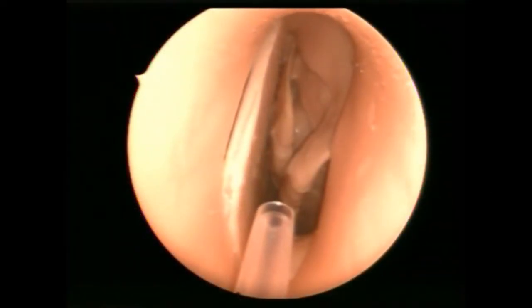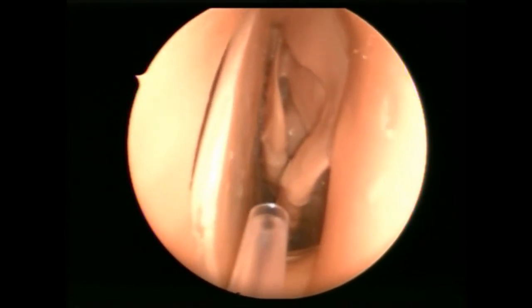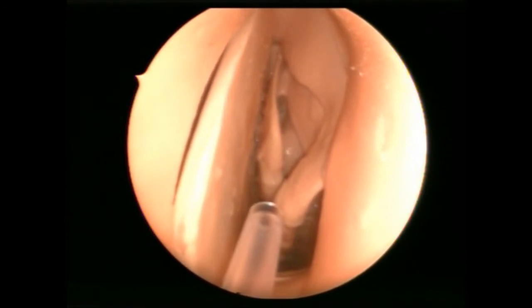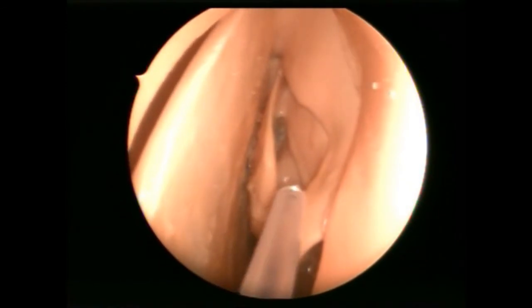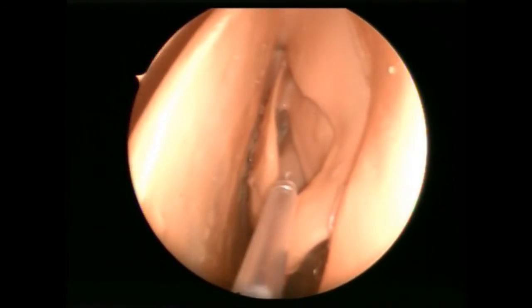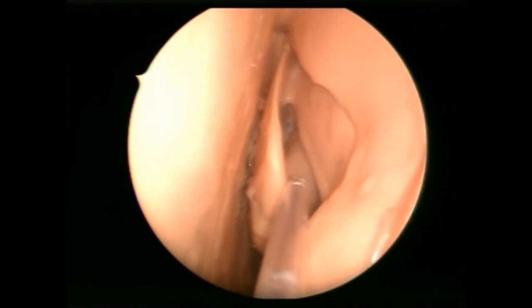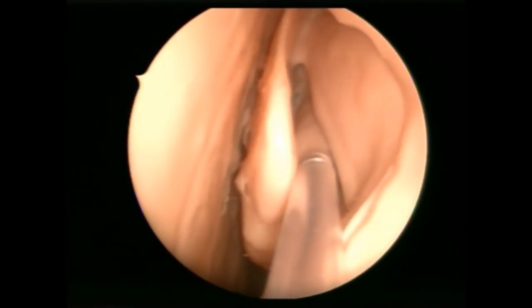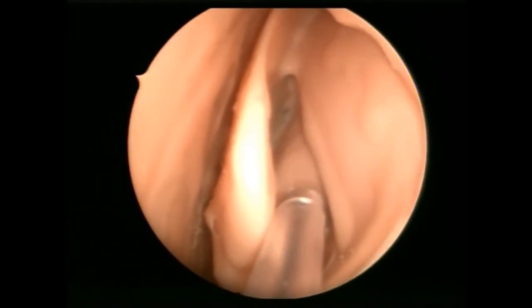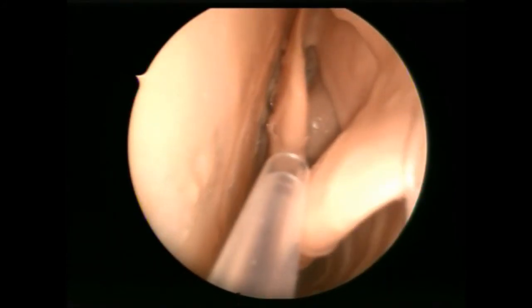When we use the sinus collector to collect the purulent secretion from the nasal cavity, we have to make sure that the tip of the catheter is covered while we're going in. And once you get in, then you gently uncover this catheter so you keep it sterile and not contaminated with the nasal floor. Once you're in, you put your finger on the control, and then it starts to suction all the purulent secretion from the middle meatus. And then again, before coming out, please note that we have to cover the tip again and then gently come out so you avoid contamination to the anterior nasal.